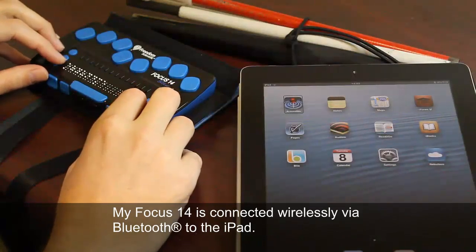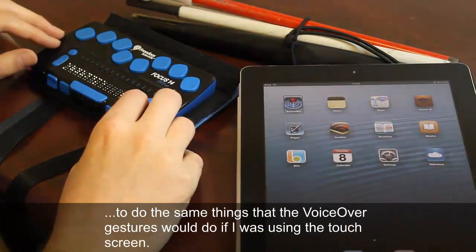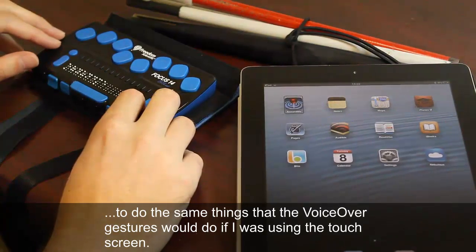My Focus 14 is connected wirelessly via Bluetooth to the iPad. I can now use the different navigational buttons on the Braille Display to do the same things that the VoiceOver gestures would do if I were using the touch screen.